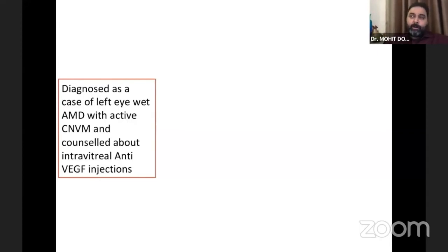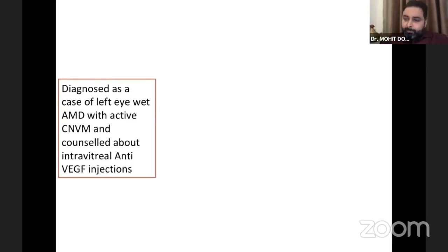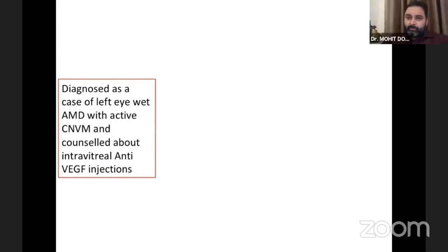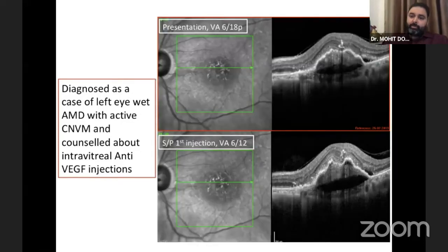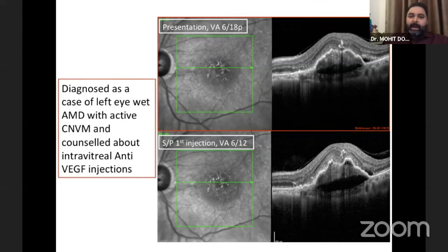It's a no-brainer to diagnose left eye wet AMD with an active CNVM. The patient was counseled and treated with anti-VEGF injections. After one injection, there was some resolution of the fluid. Since we're talking about gray lesions, the next slide might be a little tougher.